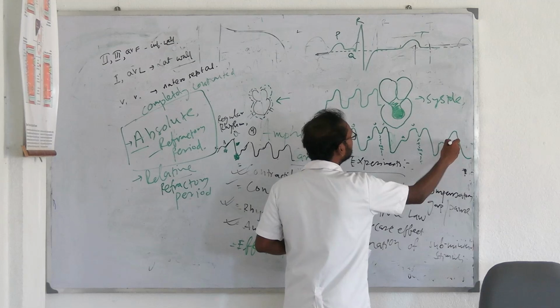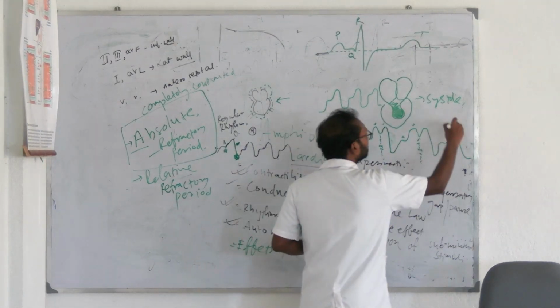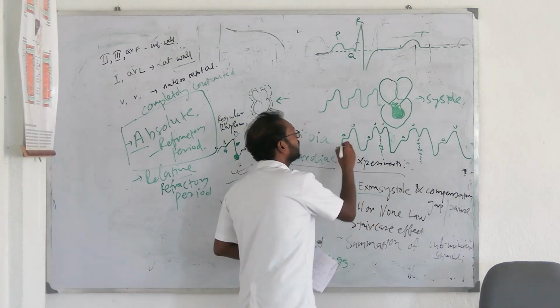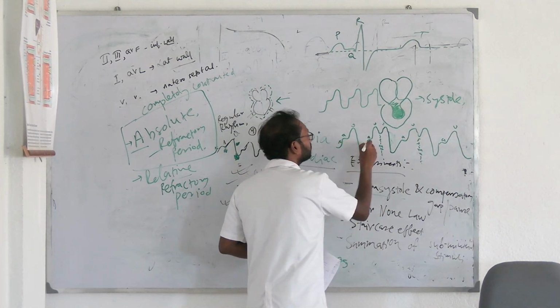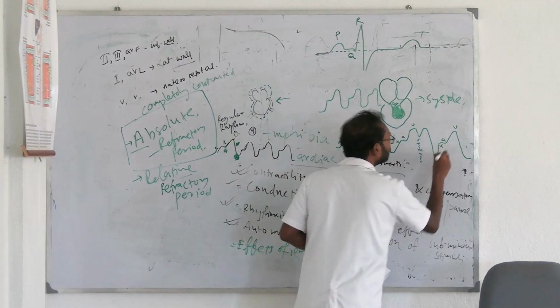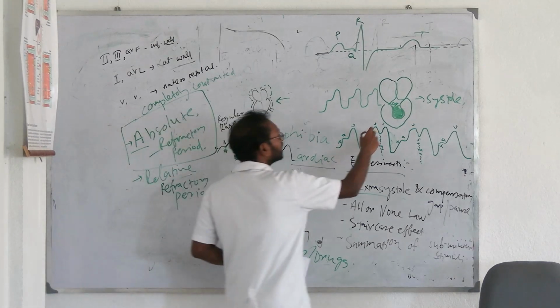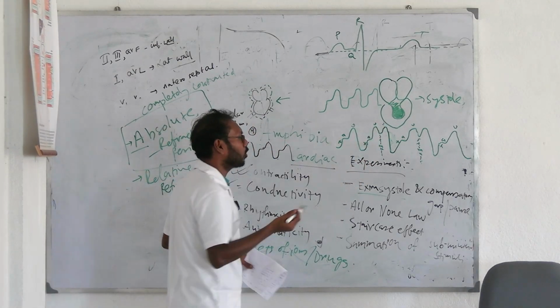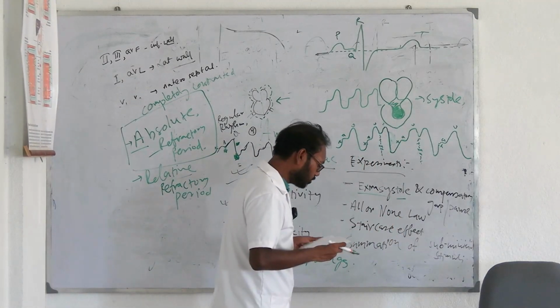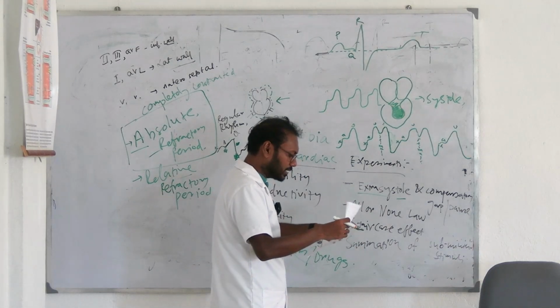Then again in this area I am not providing any outside stimulus. Readily the heart, atrial systole, ventricular systole, the heart comes to normal, and this area is for sinus rhythm. I have said this repeatedly, ask this: sinus rhythm will be present in all the graphs. So this phenomenon is called extra systole, and after this extra systole there is a gap which is called the compensatory gap.